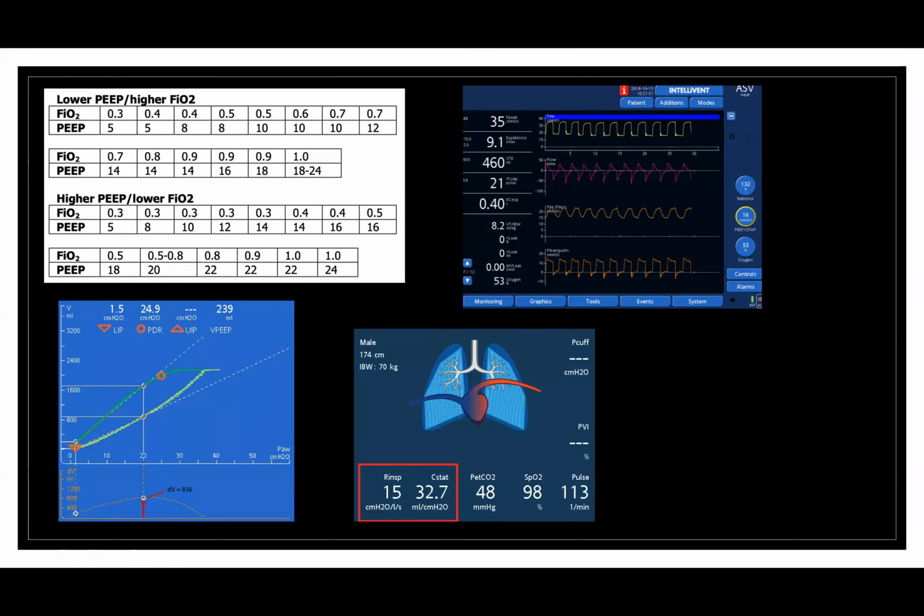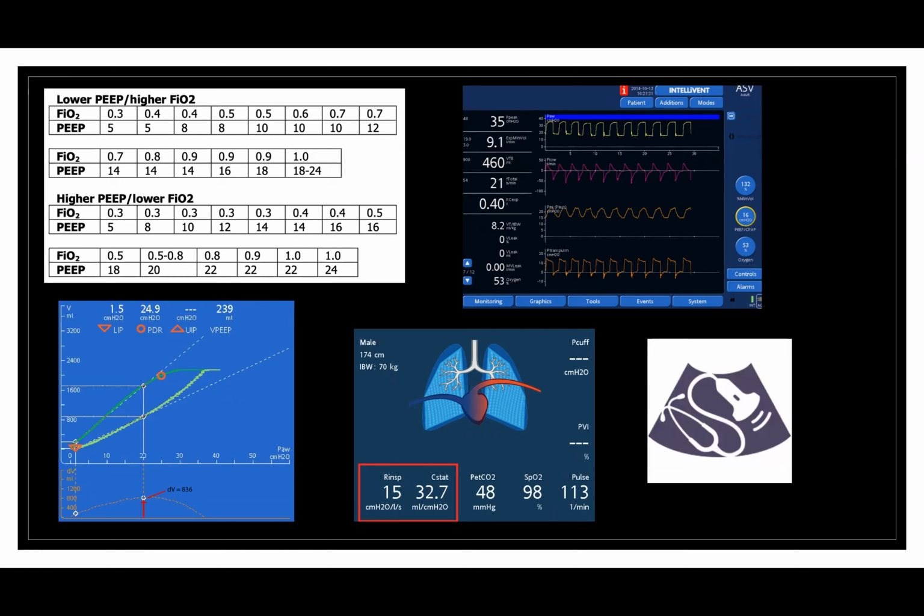We can also use the compliance that's generated by the ventilator. So this is again a screenshot. The ventilator, through its mathematical formulas that are proprietary to Hamilton, generates a compliance every second. And you can sit there every day, a couple times a day, adjust the PEEP to try and target your optimal compliance. And then of course, because this is a Western PowerPoint, I have to mention ultrasound. Dr. Arnfield has published a great paper looking at using transesophageal lung ultrasound. So we put in the TEE probe and then look at the lungs as opposed to the heart specifically as a way to tell if there's atelectasis, see what happens in real time when you recruit, see what happens at a different PEEP. So you can sort of be guided that way.